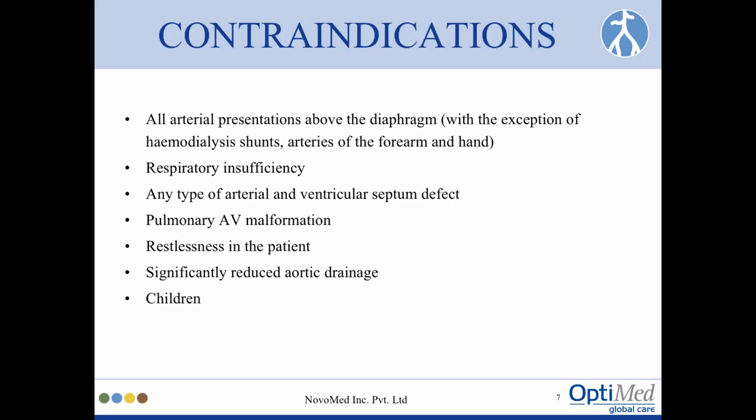One is restlessness in the patient. We need to fine tune and get mentally reconciled to the fact that with contrast, you get these brilliant pictures.